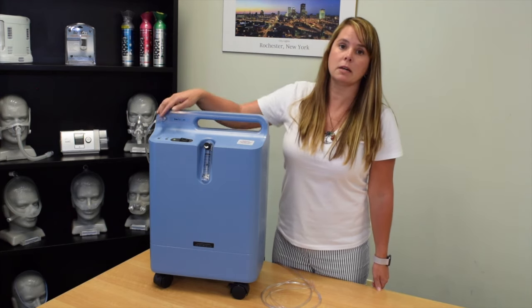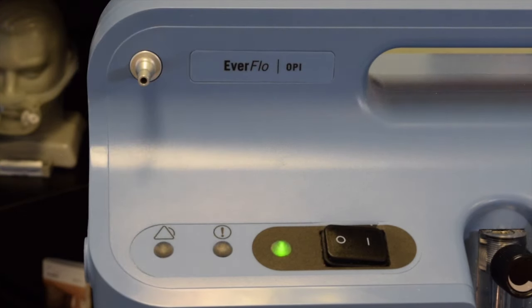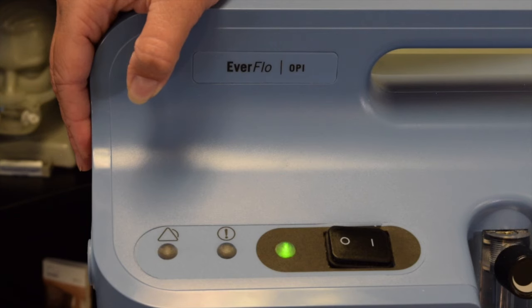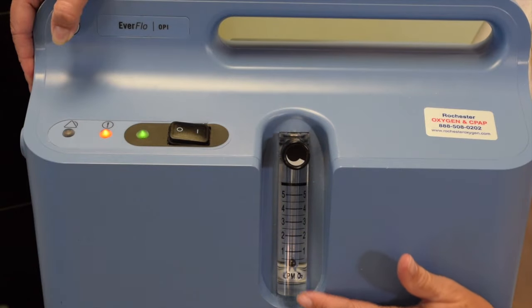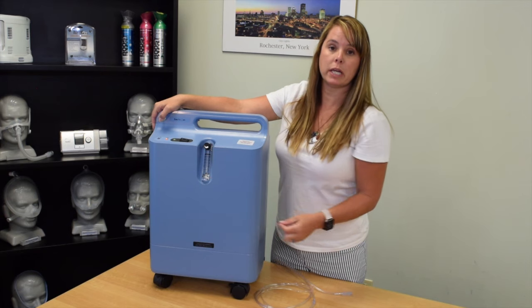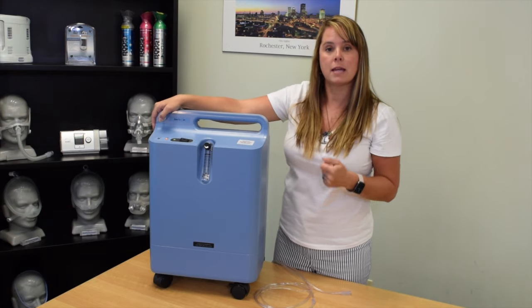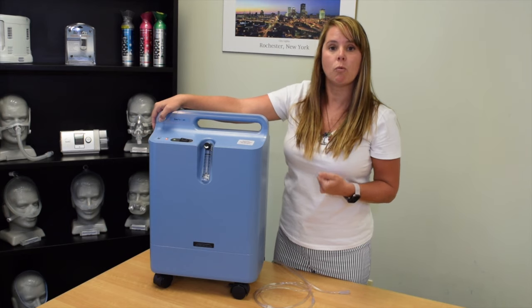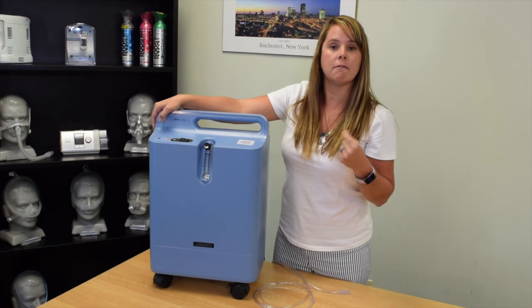In order to simulate the kinked hose, I'm going to disconnect the tubing here and block the port. You can see that we're receiving these alarms and the ball on the flow meter has dropped all the way down to the bottom. What I'd like you to do is follow your tubing from the outlet all the way around to your cannula and see if you can find that kink. If you feel there is no kink in the tubing, remove the tubing from the outlet and see if the alarm stops.